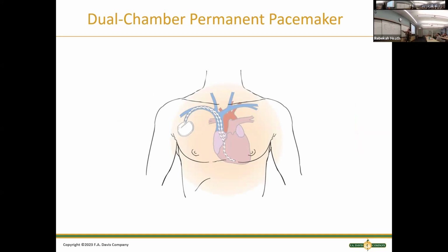Pacemakers will usually live on the left side of the chest. This one shows them on the right. When you guys are going to clinicals, if you have a patient with a pacemaker, I want you to palpate their chest because you can feel the pacemaker. You plant it under the skin, and it's usually about this big. It's usually a hard plastic piece, but you can feel it.